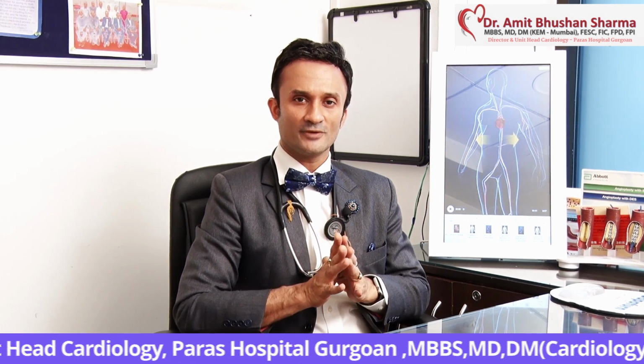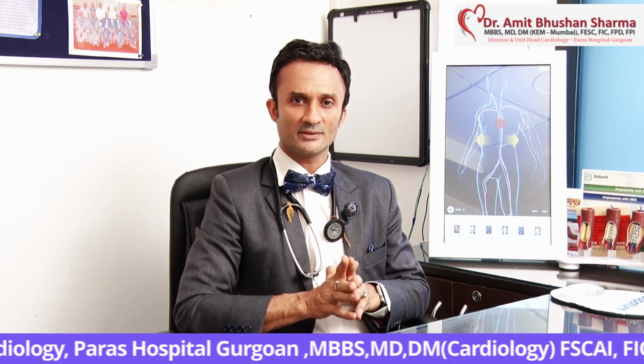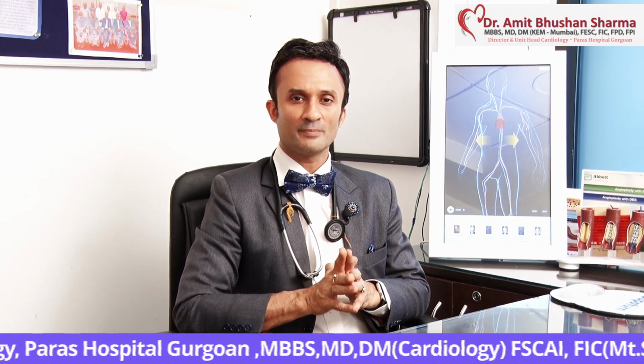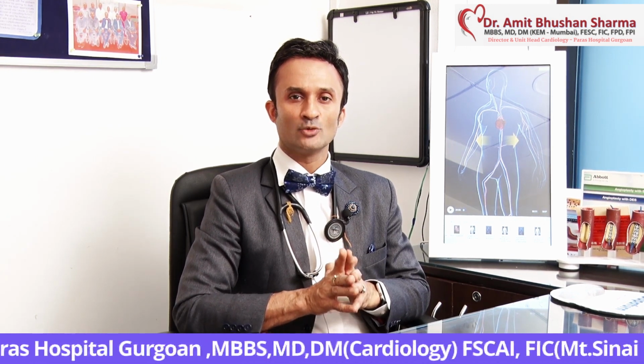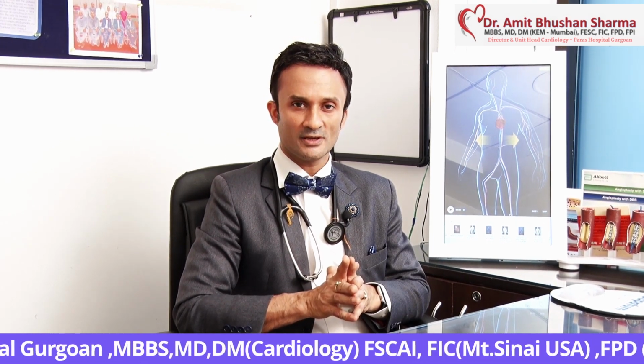CT coronary angiography is meant for a younger individual, 15 years age, 20 years age, who has like a muscular pain, atypical pain, and you know for a fact it is not cardiac. Then you do a CT coronary angiography.